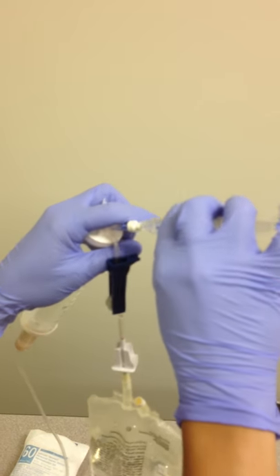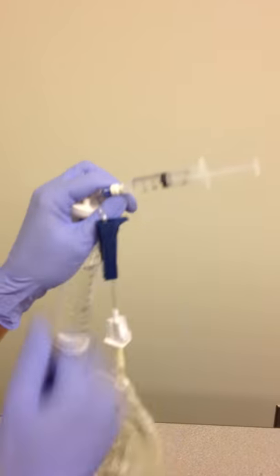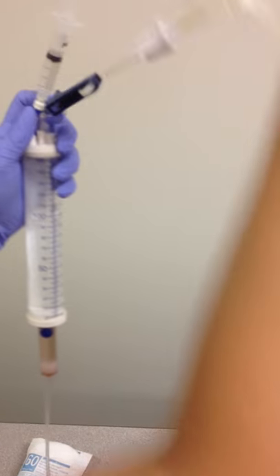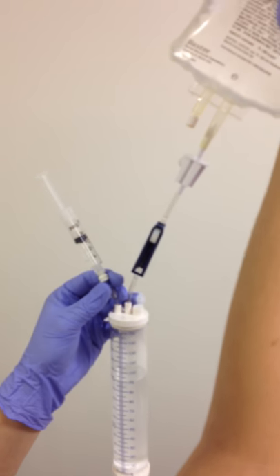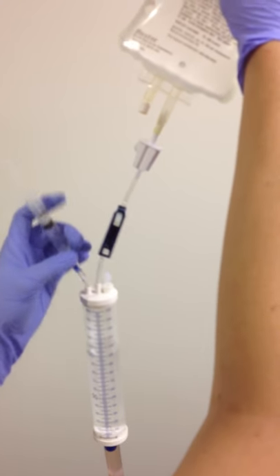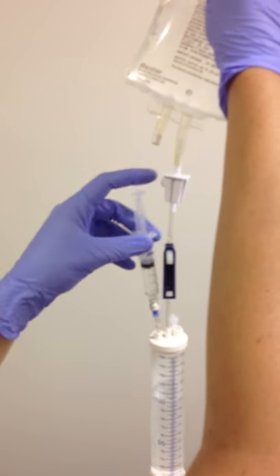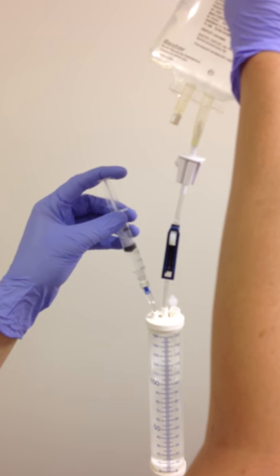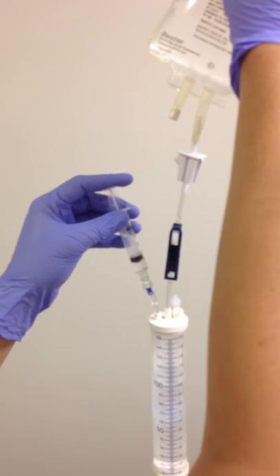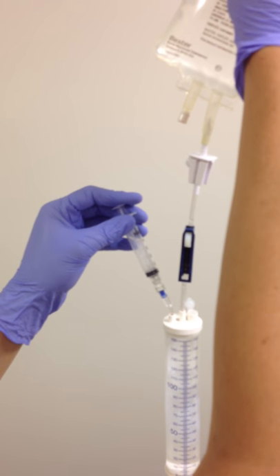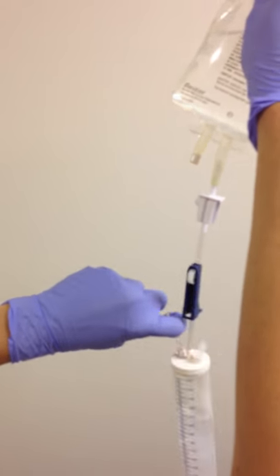We will inject that into our medication port, which is the port beside the D5W thumb wheel. Now inject the three milliliters slowly. Amiodarone tends to bubble up, so we will inject it slowly.